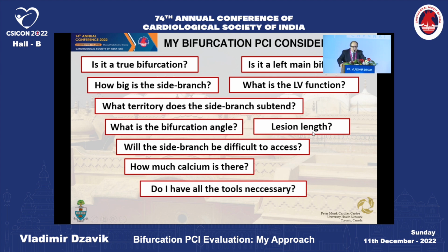Do we have all the tools related to what I just said? All the tools doesn't just mean equipment, and we need to make sure that we have the equipment necessary in-house. It can happen that you start a procedure, and in my setting that happens unfortunately, and I find out in the middle of the case that I don't have a certain cutting balloon, a Wolverine of a certain size that I need, or something like this. So it's important that we know ahead of time, before we begin a case, that we have all the tools.